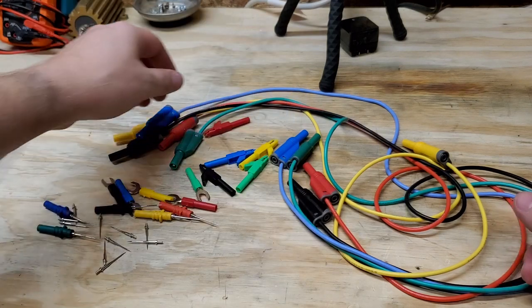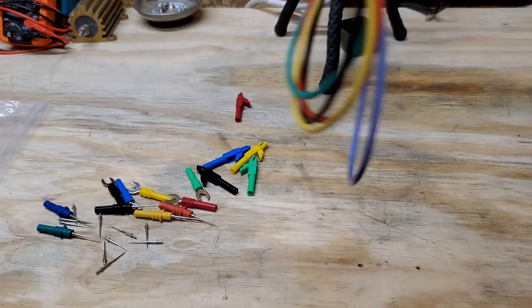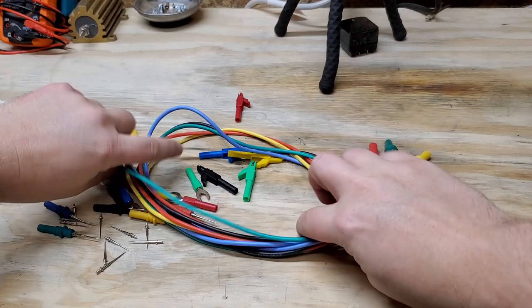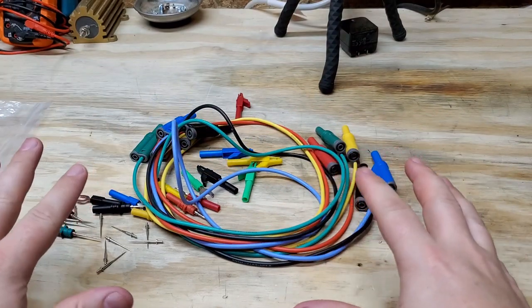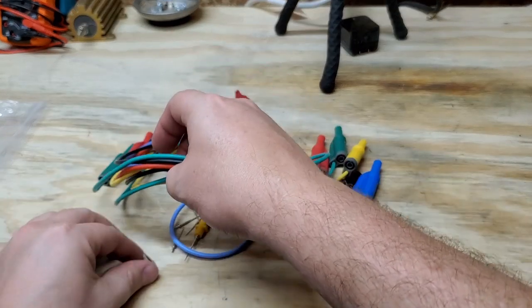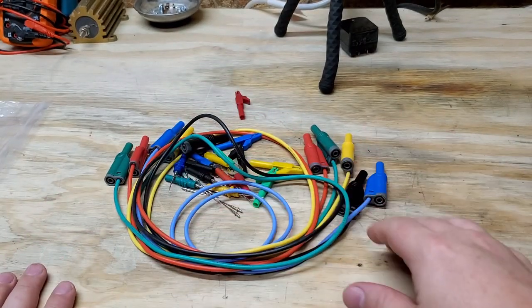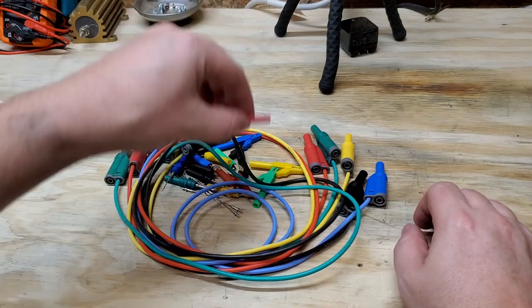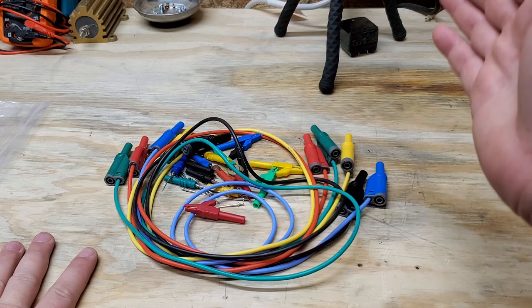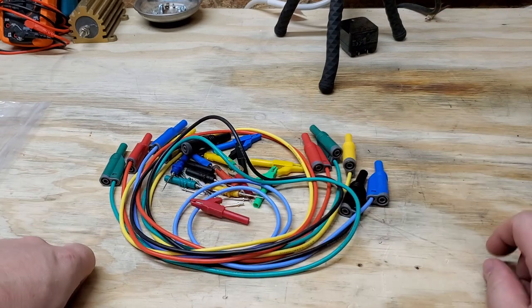If you were to go to somebody like Fluke and order a set of test leads it's going to be well over a hundred dollars, and that's why I'm always looking for alternatives. Every analyzer needs to have its test leads, so if you lose some, go ahead and buy one of these replacement sets — keep them in a drawer. You can also configure them for ESUs, have them pre-bagged up. At twenty-eight dollars, that's almost nothing — that's an incredible deal.